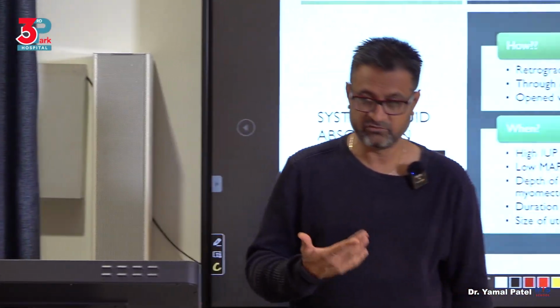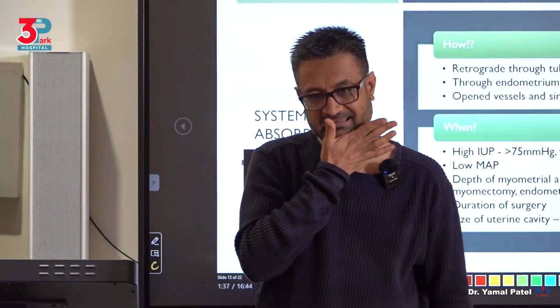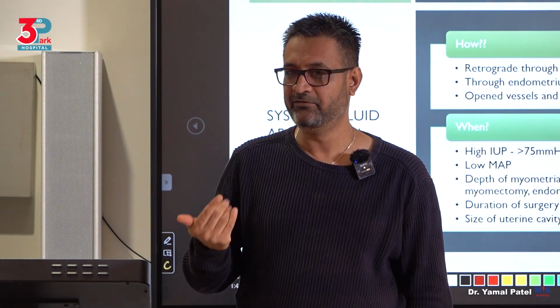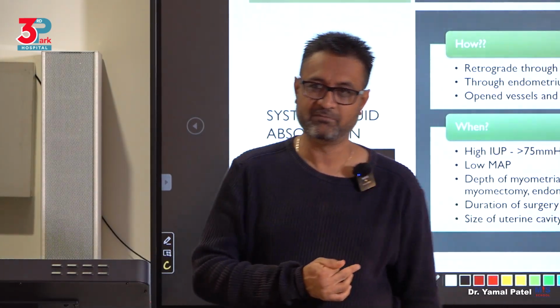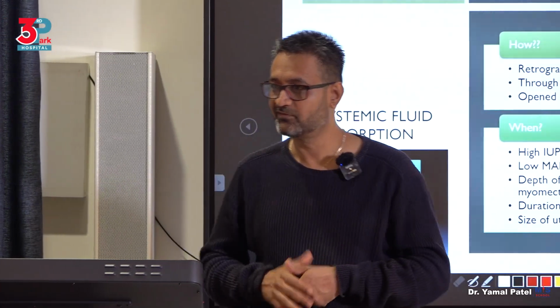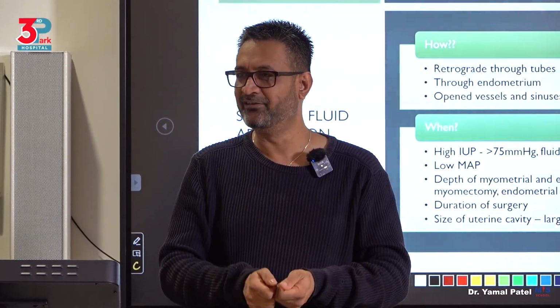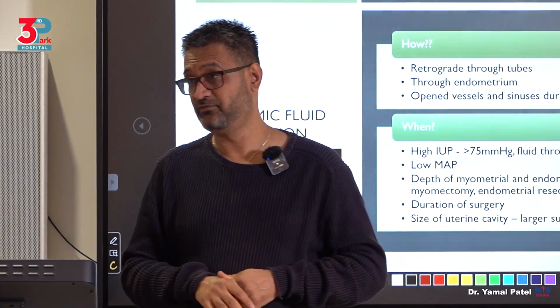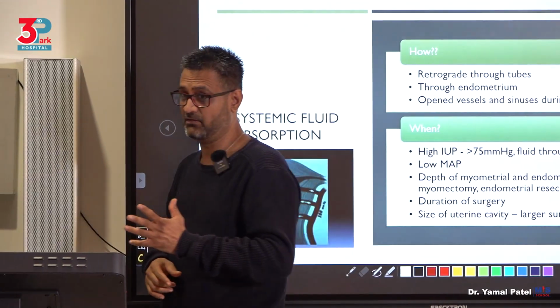I told you in a normal diagnostic hysteroscopy, which I do for all my patients, I don't take more than 1 to 2 minutes. And even in operative procedures, I don't take more than 15, 20 minutes. But these are my figures now after so many years. I know people can be in there for 45 minutes to an hour to 1.5 hours doing hysteroscopy. Trust me, if you're doing that, you are overloading that patient by the duration you're taking. Okay, it's not right.